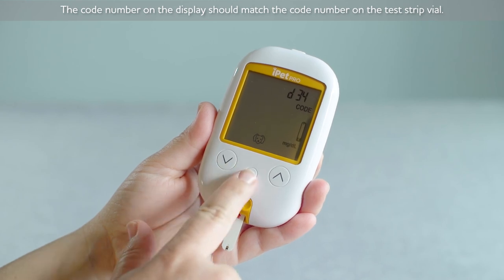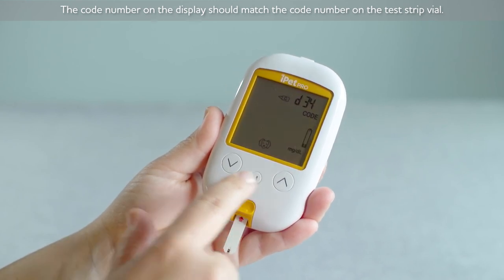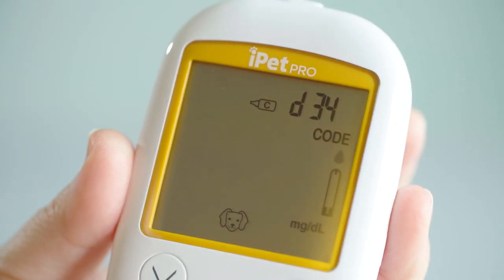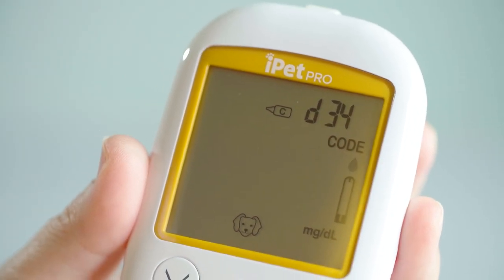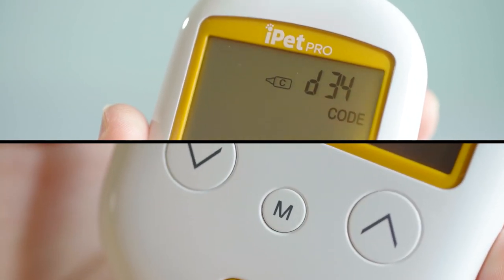Press and hold the M button down for 2 seconds to change to the control solution test mode. This ensures the control solution reading will not be stored in the memory. You can switch in and out of test mode by holding down the M button for 2 seconds.